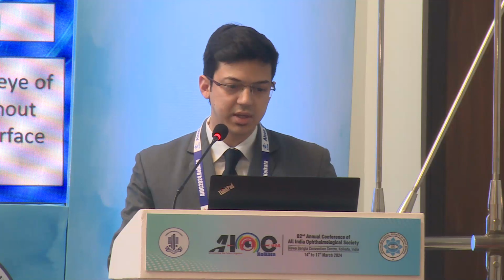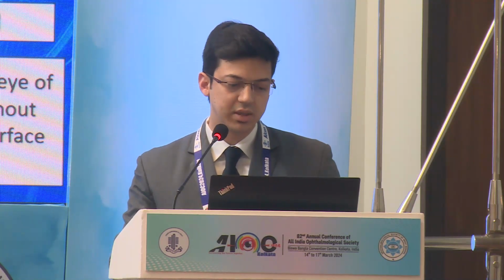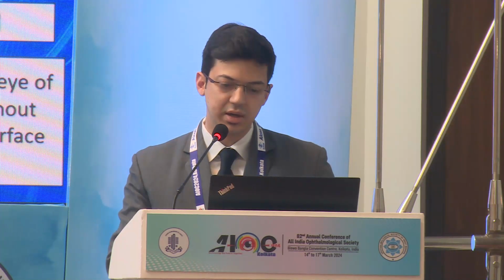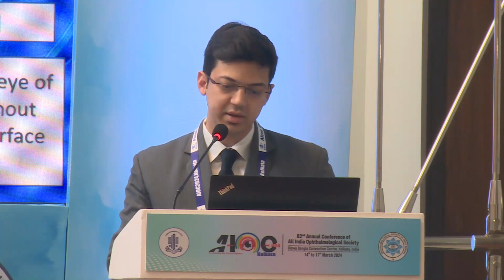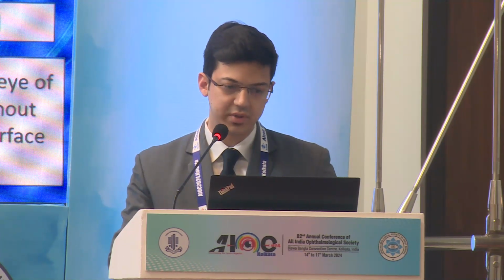So for this study, slit lamp images were retrieved in a 10-year period and were divided into 3 different data sets. One was HP proven or clinically diagnosed OSSN. The other was surface disorders other than OSSN. And the third group was the normal eyes of the patients without any ocular surface disorder. So any unclear photos and patients with ambiguous diagnosis were excluded from the study.